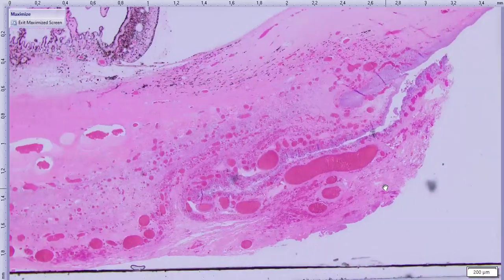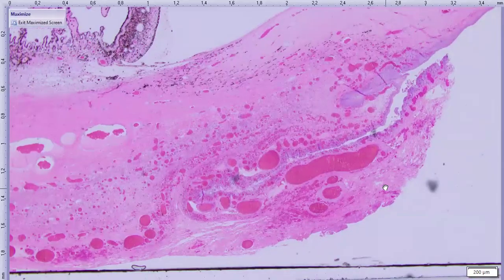Moving back up here, look at how congested the conjunctiva, episclera, and orbital connective tissue are. So many large, dilated, blood-filled vessels here, extremely congested, edematous and hemorrhagic tissue. You can see the hemorrhage between the vessels here.